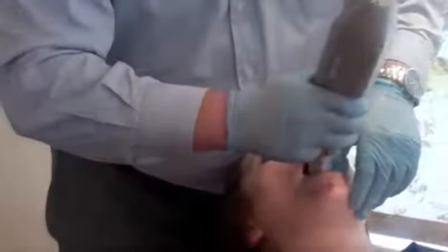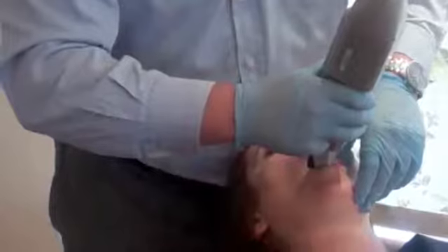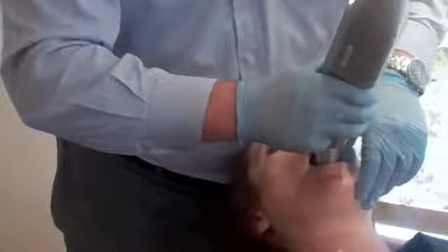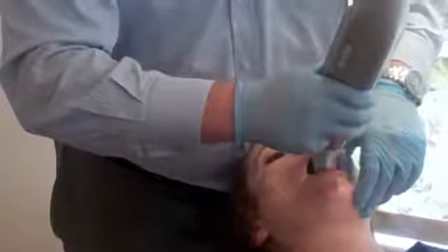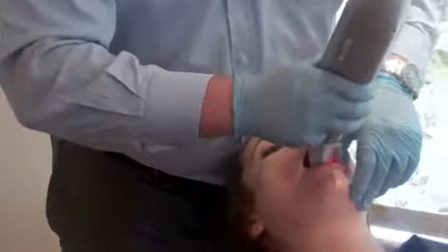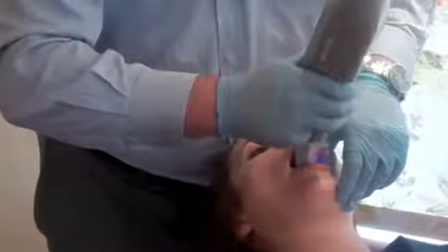So you're doing the lowers now? Yeah, doing the lowers now. Why do you have to do the lower if you're doing? Lingual view of lower left 6. It's totally customizable, so if you wanted to, you could change that. Lingual view of lower left 4. It's just been the way it's been set up.